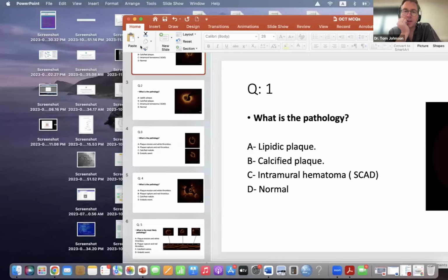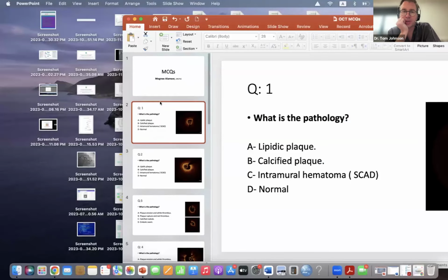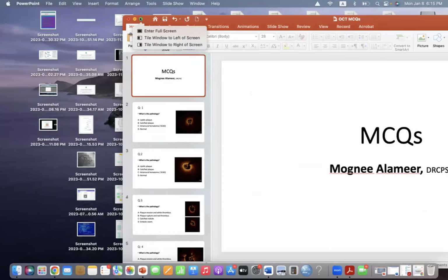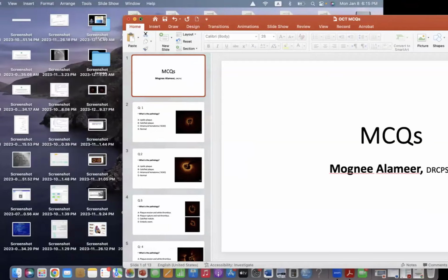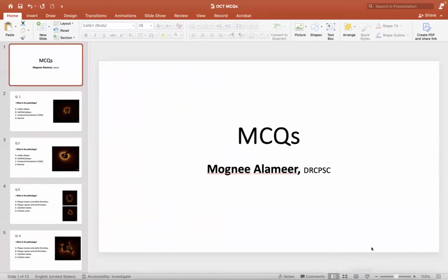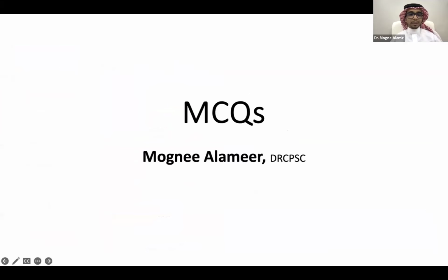But while Mogne does that, do you use a pump injector or is it a hand injection for your contrast clearance? We used Assist. Okay, so that gives you a fairly standardized and clear clearance. Actually, for me, sometimes I use hand injection. Sometimes for the left system, it's not perfect. For the right, RCA, it should be okay.